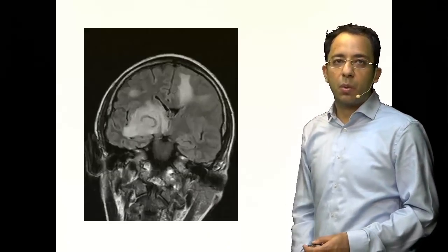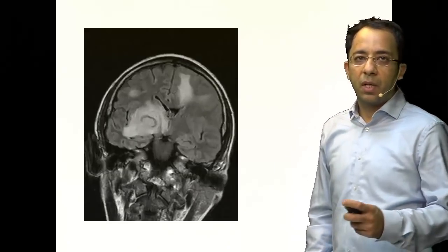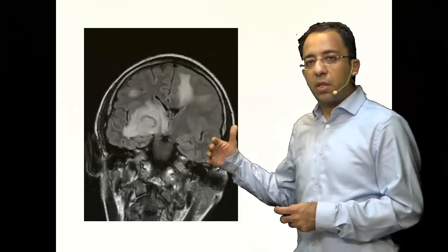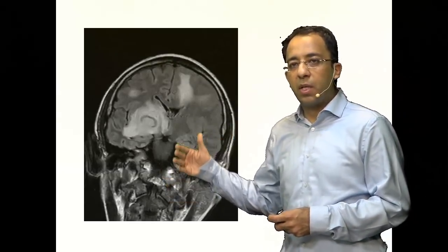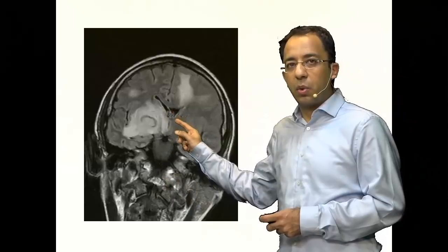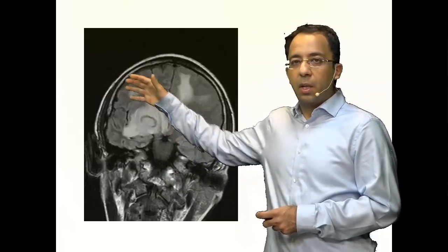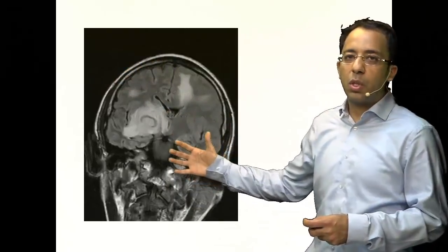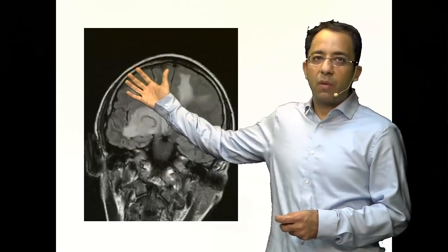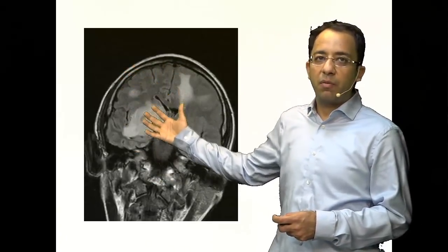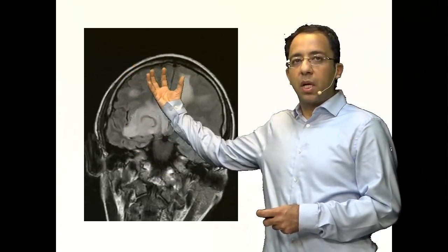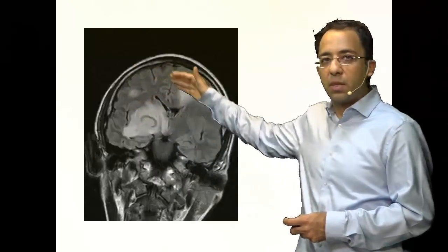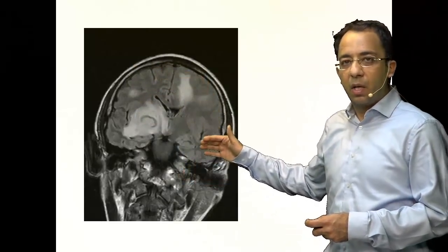This is a FLAIR image — it is a T2-weighted image with dark CSF. You can notice the CSF is dark, but the brain parenchyma retains the characteristics of a routine T2-weighted image. The gray matter appears brighter compared to the white matter.